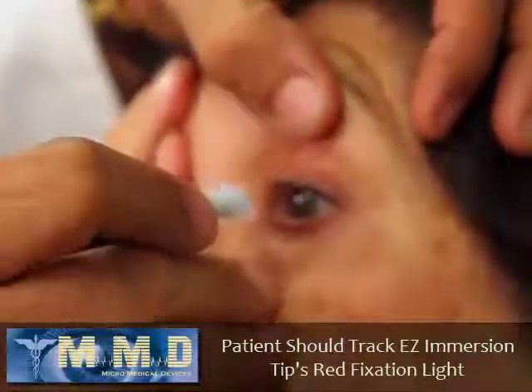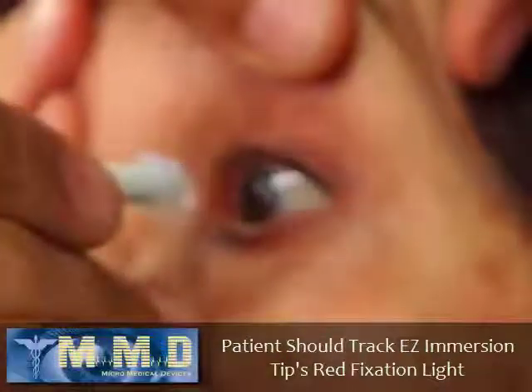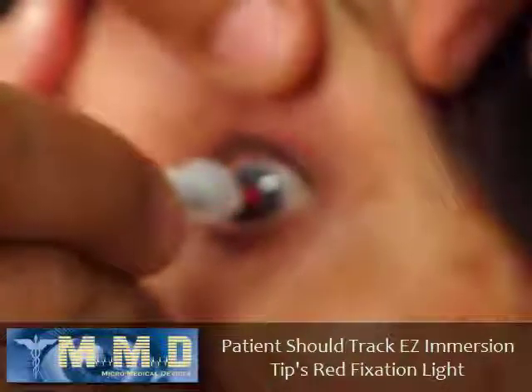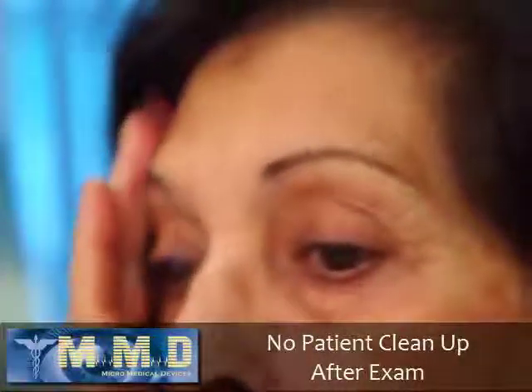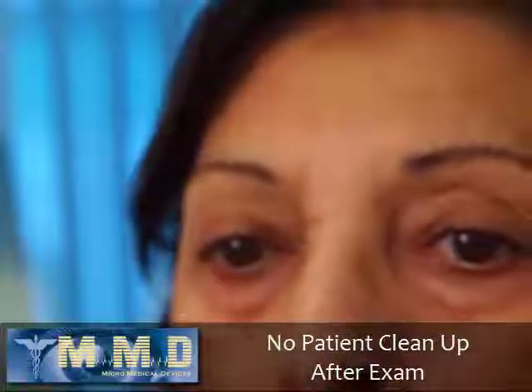So the main thing to remember is if the machine is not capturing when you touch the eye, don't press on the eye. Just hold it stable and ask the patient to look at the blinking light. Please look at the blinking light. So first I move it a little bit to make sure that the patient is fixating properly, and then just bring it close enough, and then you're done. And basically that's all it takes to do a successful immersion biometry without any mess on the patient.